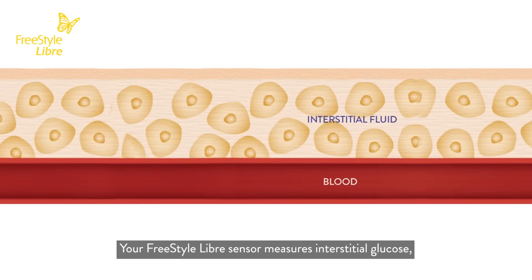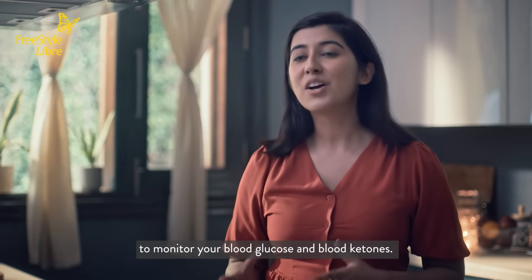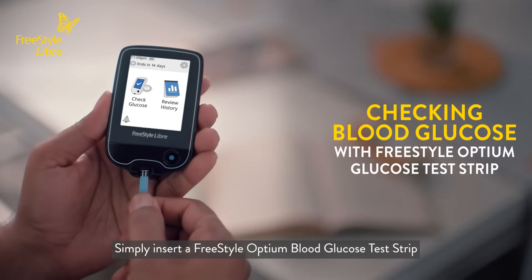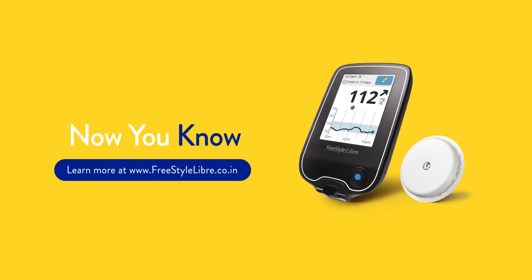Your Freestyle Libre sensor measures interstitial glucose, which is the glucose in the fluid around the cells. But you can also use the Freestyle Libre reader to monitor your blood glucose and blood ketones. Simply insert a Freestyle Optium blood glucose test strip or blood ketone test strip. It's really that simple.